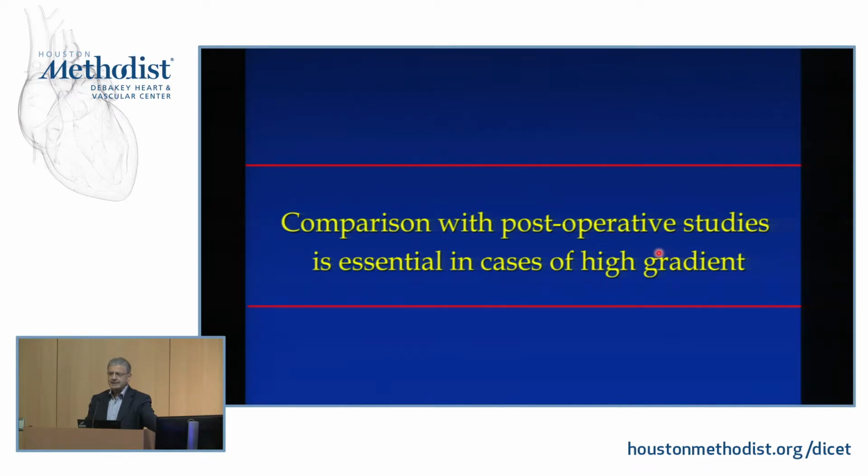Ideally, the baseline exam is about 2 months down the line. But this is the ideal world, and we need an echocardiogram most often early on to assess the outcome, be it surgical or percutaneous valve. Particularly in the surgical area, you always evaluate before somebody goes home, what's the ventricular function like? Is it depressed? Do I need to change my medications? Is there a pericardial effusion? How should I modify my management?